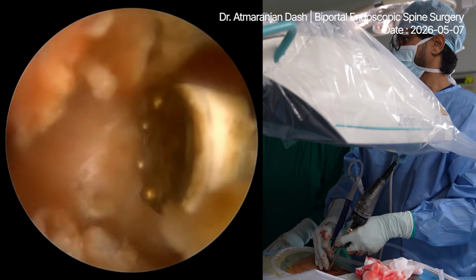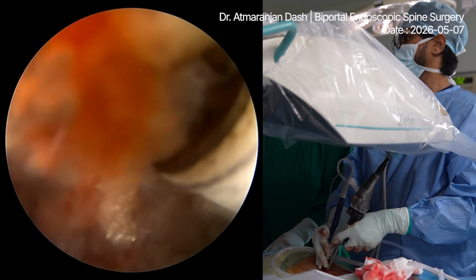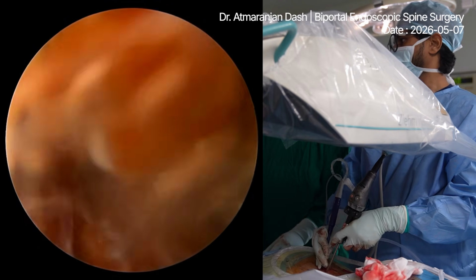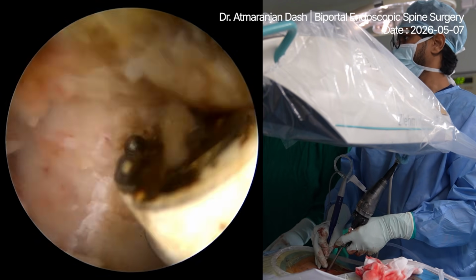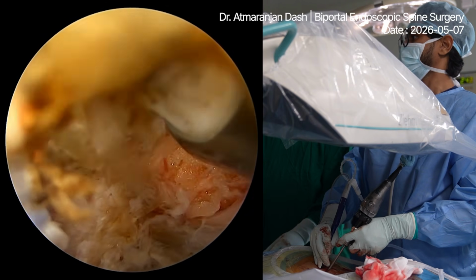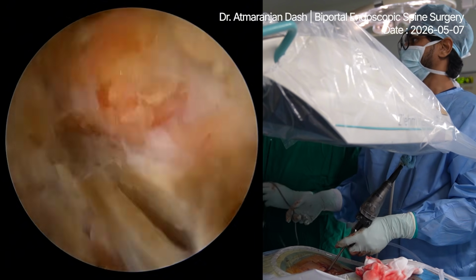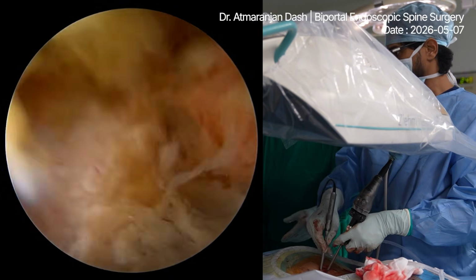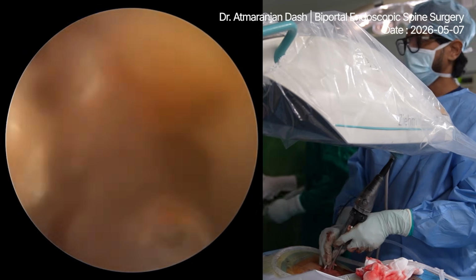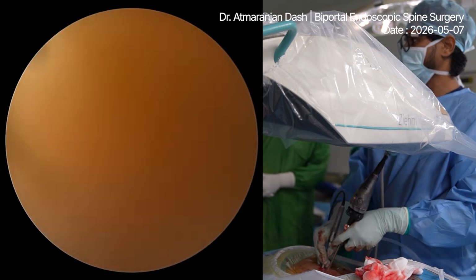So this is the TP area just below the coagulation, just below the ablator. Just below the TP area you will get the foramen. So this is the area for the foramen. I'll drill this area. Okay, drill please. Just below the foramen.